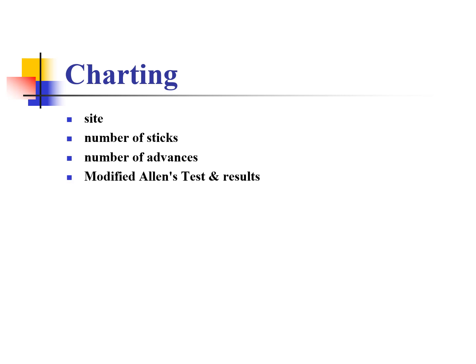You always need to chart a modified Allen's test results. Was it positive? Was there collateral circulation? So you want to be positive, right? You want a positive modified Allen's test. I'll repeat that again. You want a positive modified Allen's test. Yes. Positive is good in this situation. You always want a positive modified Allen's test.